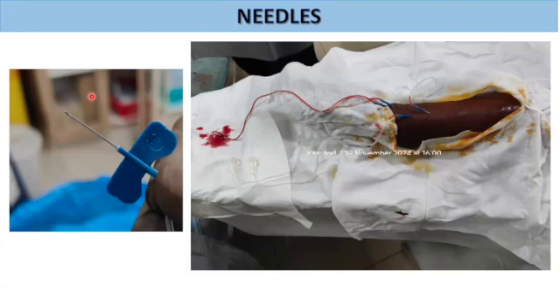As we know, this was a physiological thrombus, not an anatomical thrombus. We had achieved significant success, so we did a multiple puncture needle method. Why multiple? I have seen many interventional nephrologists also use an insulin syringe to give the thrombolytic directly into the thrombus. But in this case, we used scalp needles at multiple places in the thrombus where the thrombus burden is high. The thrombolytic was diluted and given in multiple pulsed frequency. And today the patient was dialyzed and the fistula was completely thrombus free.